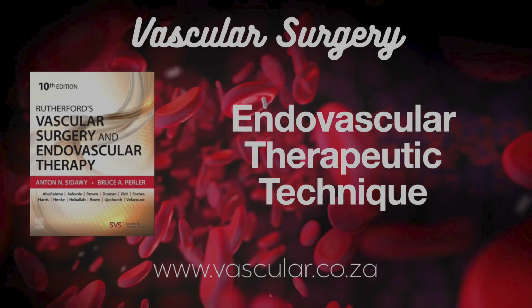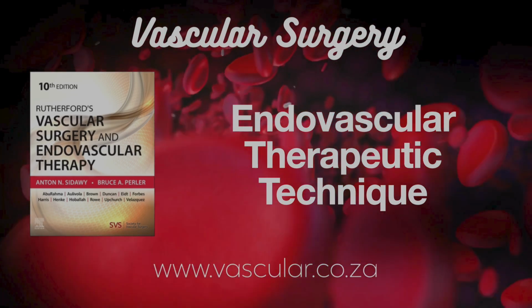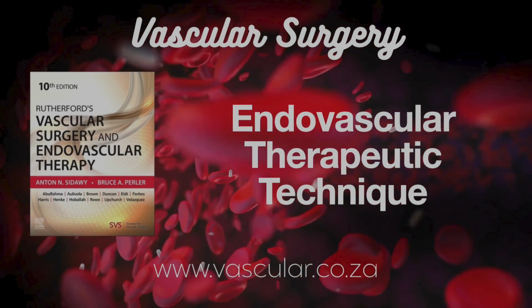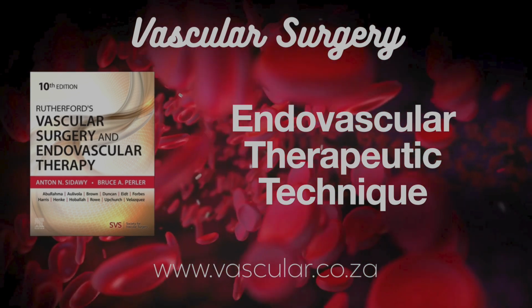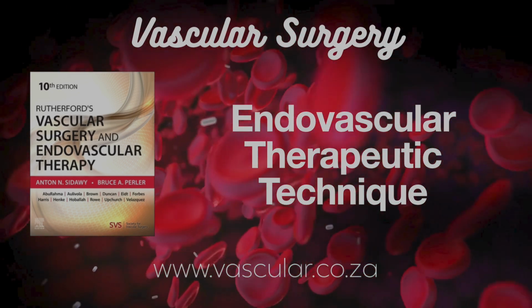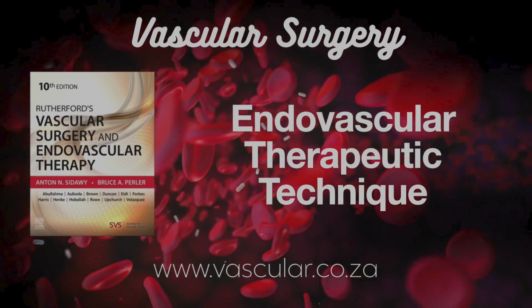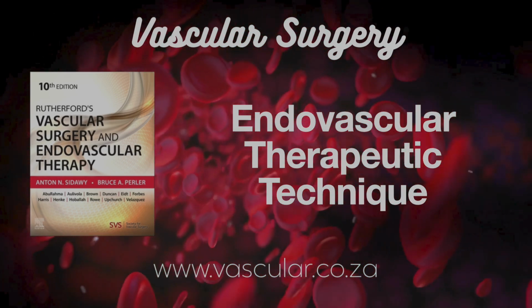Technique for implanting a balloon-expandable stent. Size it 5 to 10% larger than the reference vessel. Predilate the lesion well to avoid stent dislodging. Get the wire across, confirm position, mark the lesion. Advance the balloon-mounted stent, confirm position with contrast. Withdraw the sheath. Inflate the balloon under fluoro. Watch for even expansion. The dog-bone appearance is normal initially. Ensure no dislodgement. IVUS helps confirm apposition. Keep wire position. You can post-dilate BES further.